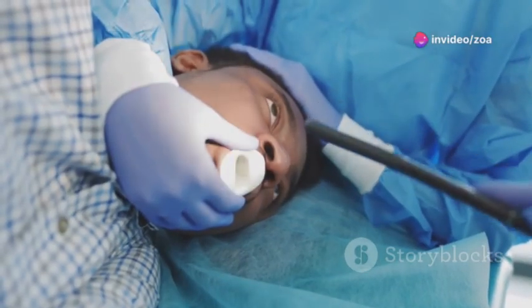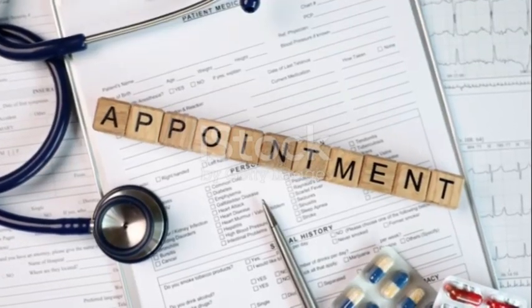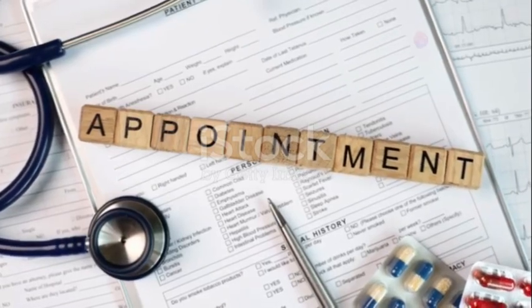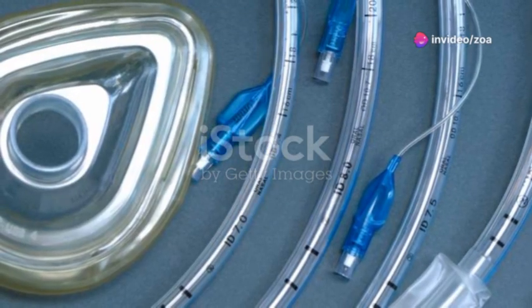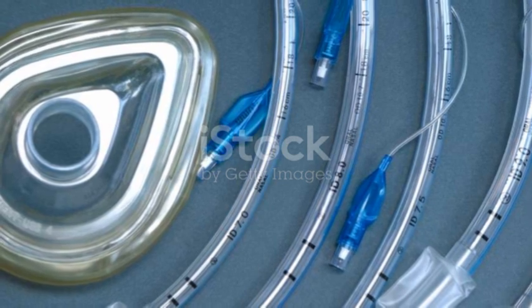Advance the tube until the tip reaches the posterior pharynx. Listen for breath sounds as you advance the tube. The sounds should become louder as the tube approaches the larynx. During inspiration, gently advance the tube through the vocal cords. If resistance is met, withdraw the tube slightly and try again during the next inspiration.